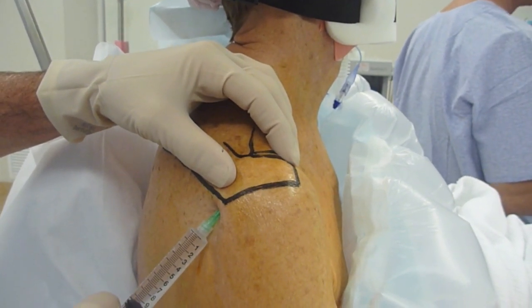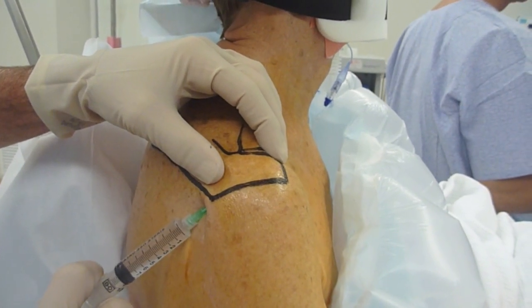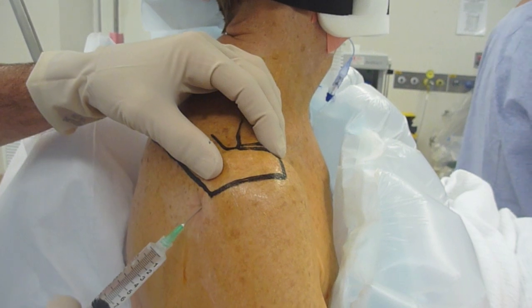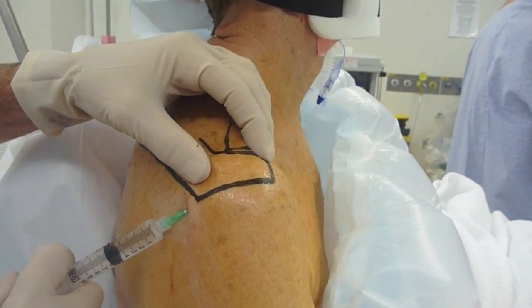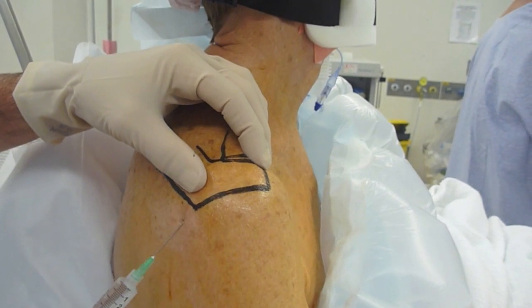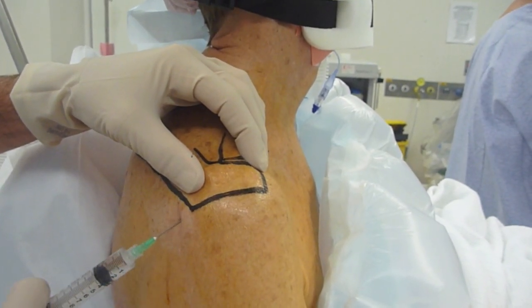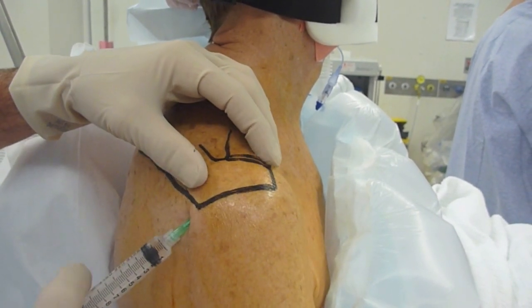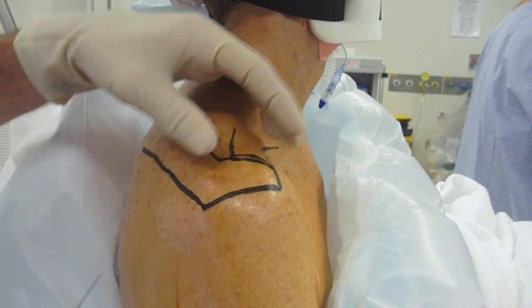As you can see, when I started injecting the resistance was too great, but now when I've got into a better position I feel the fluid going in easily. As you can see, there are multiple passes and multiple small injections of fluid. You might think this would be painful with the patient awake, but it is not, so long as you don't take the needle out completely and do a new puncture of the skin. So as you can see, multiple injections but each time feeling very minimal resistance.